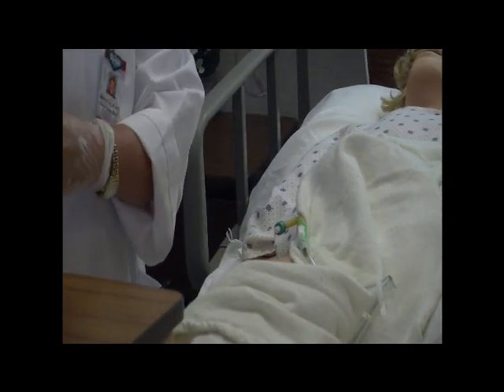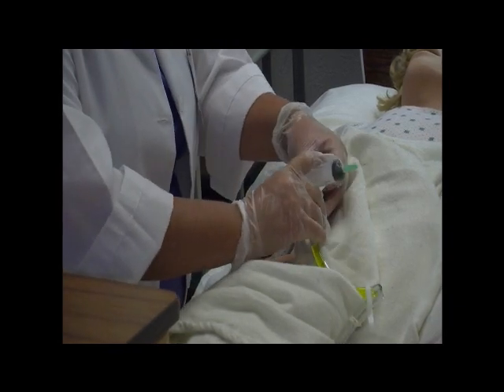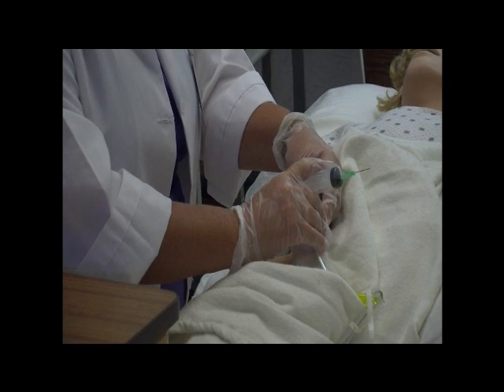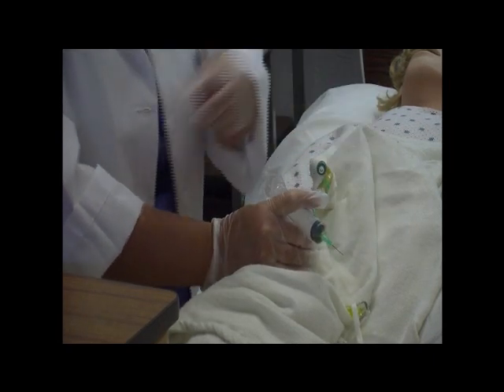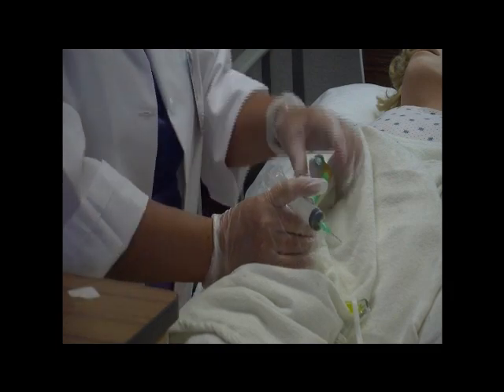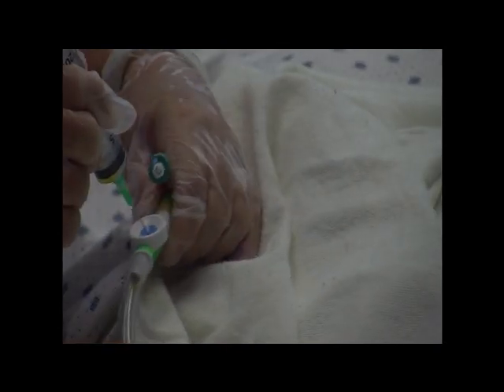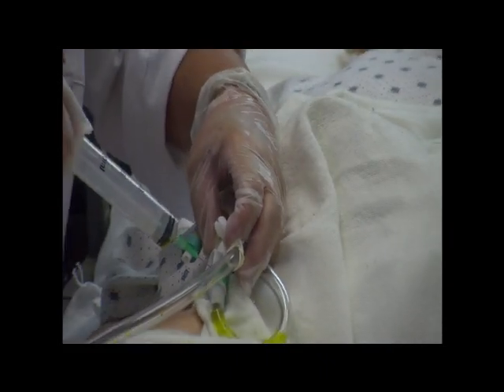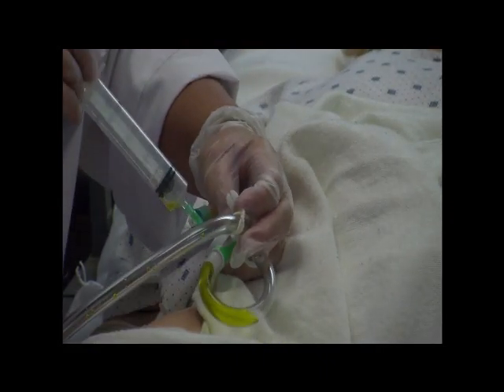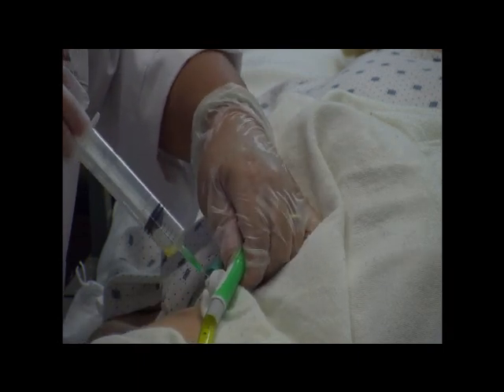Open the alcohol wipe and the syringe. Clean the little port with an alcohol wipe. Insert the syringe, taking care that your fingers aren't right below this port so that you don't penetrate your skin.